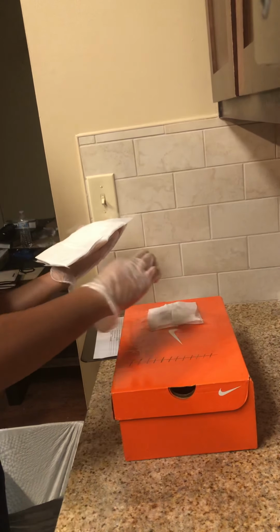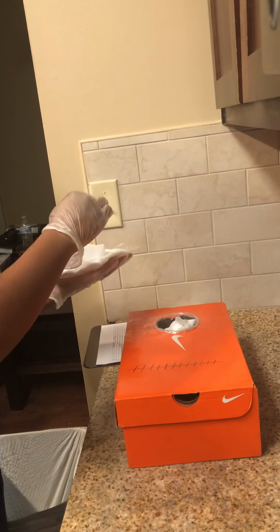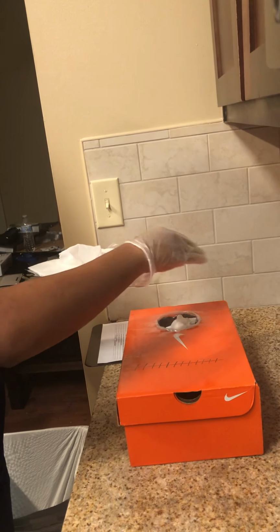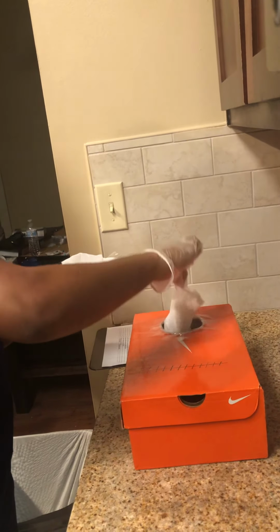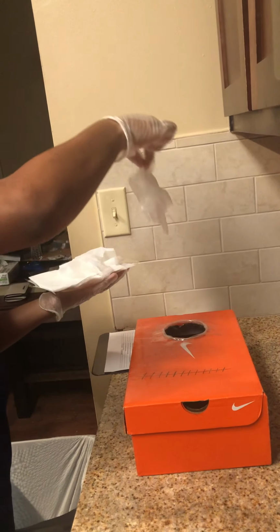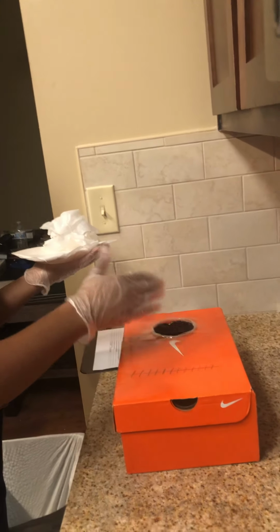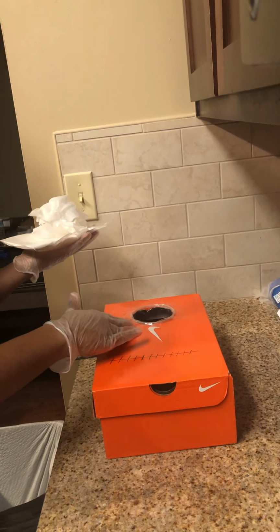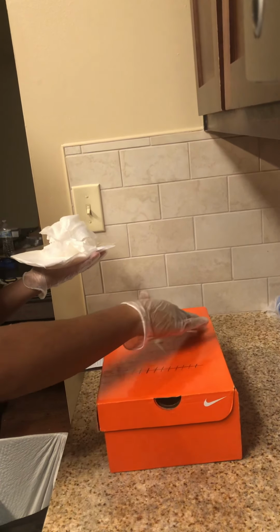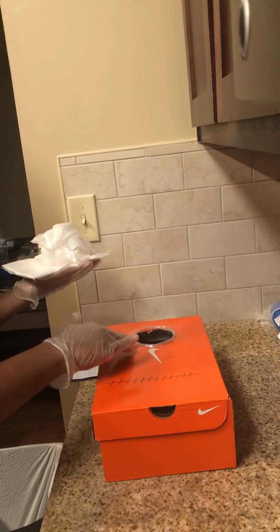I will now remove the inner layer of the dressing and the stuffing without touching the peri-wound area. I will now palpate the peri-wound area to assess for redness, edema, or if there's any tenderness to the patient.